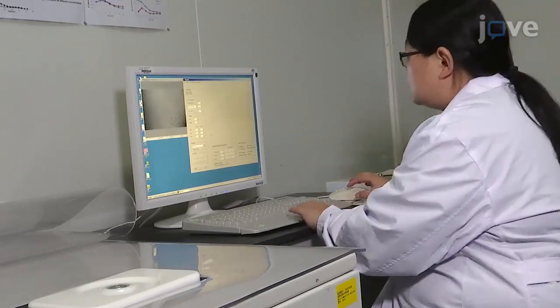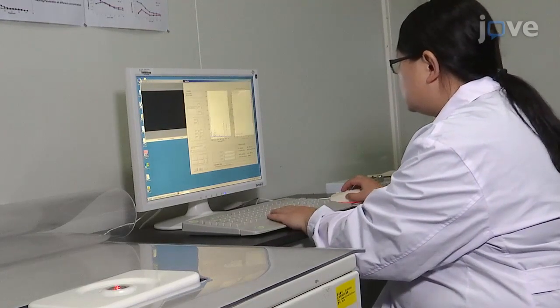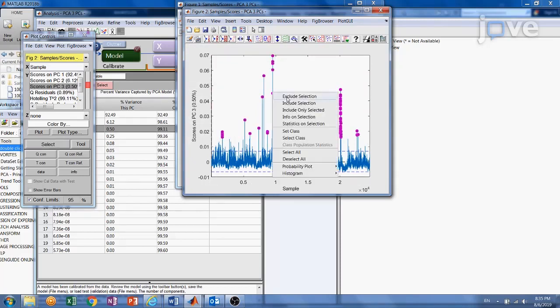The main advantage of this technique is that it allows for the clinical Raman dataset to be collected by trained instrument operators who lack the technical expertise to identify, exclude, and remediate all sources of spectroscopic artifacts. The resulting dataset can then be processed to identify outliers that need to be excluded from the data prior to analysis.